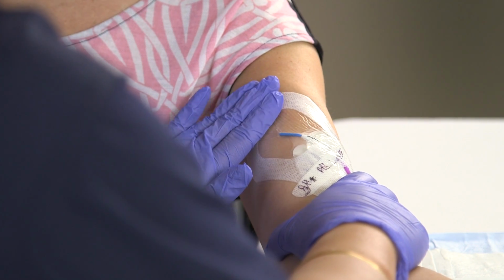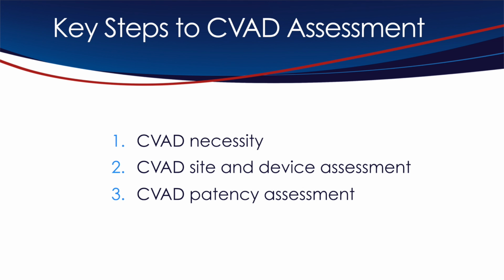In conclusion, the 3 steps to a CVAD assessment are important and easy to do. Remember to note any issues with the device, the site, and when flushing or aspirating through the CVAD. Finally, once an issue is identified, ensure prompt intervention to prevent further complications.